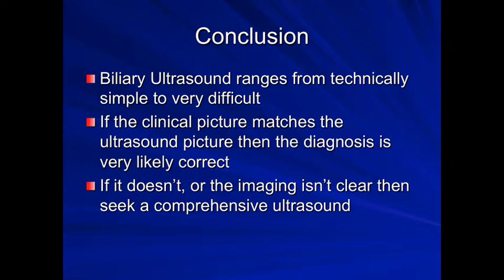So in conclusion, biliary ultrasound ranges from technically simple to very difficult. And when you're starting, then if you come across a patient who is difficult, then make sure you ask for some assistance. If the clinical picture matches the ultrasound picture, then most likely your diagnosis is going to be spot on.